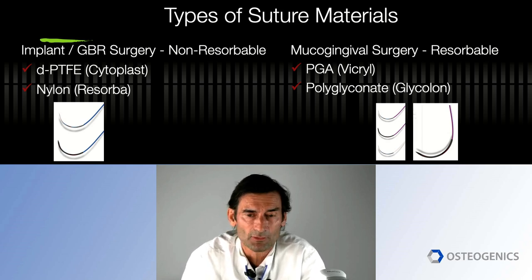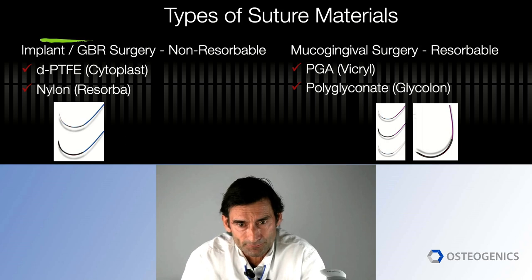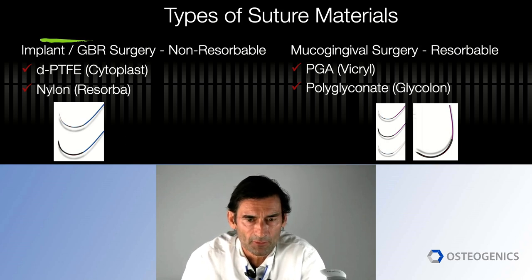Basically we have two types of sutures which are important in practice. One is the non-resorbable type, the other one is the resorbable type. Now when you're thinking about non-resorbable, when do I use that?